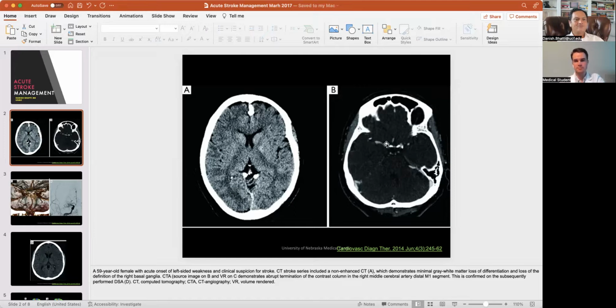And what they're showing is that this blood vessel starts and goes laterally and abruptly stops. Now, the other blood vessel is only visible as a dot because this branching or spread of the blood vessel is at a different cut. So either the X-ray or CT scan was slightly tilted, which is common, even with the best of adjustment, there is a few millimeter difference between right and left side, or the human anatomy is tilted. So human anatomy is not perfectly mirrored. So if you see a blood vessel on one side, you may not see the exact same slice, you may see it above or below the slice.